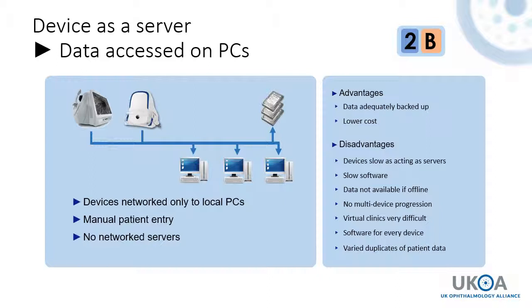It can mean a piece of software for almost any device on the network. Virtual clinics are still very difficult because the data is not always available. And again, you've got manual patient entry into the devices, so there's duplicates.